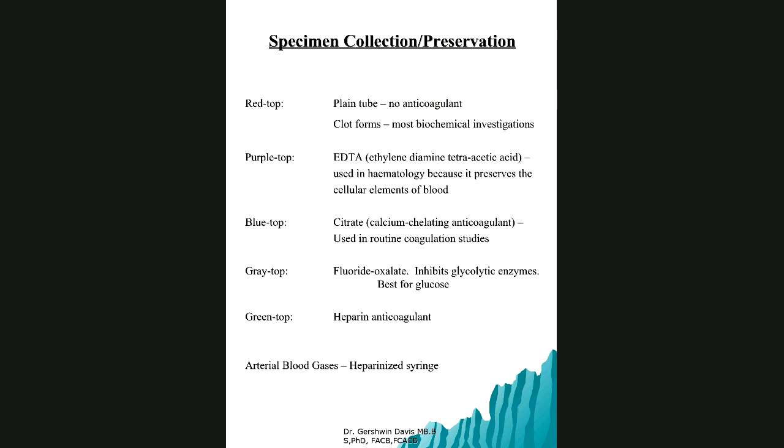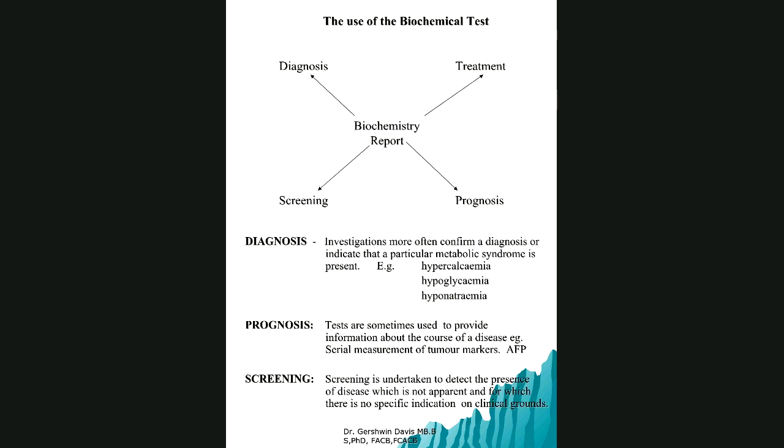All of those are tubes. Please be familiar with them. These here are the most common ones in our environment. Everybody knows EDTA. Right, good. Biochemical tests: diagnosis, prognosis, and screening. So please do a little more reading on this. The major reading is indications for screening tests.